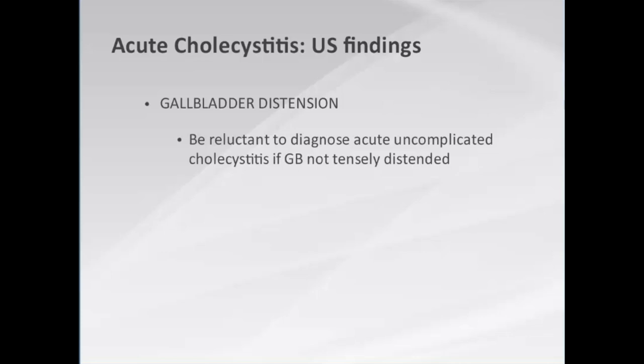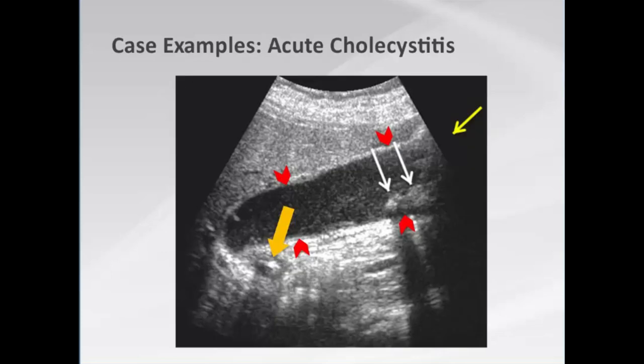Here is a teaching pearl: be very reluctant to diagnose acute uncomplicated cholecystitis if the gallbladder is not tensely distended. A woman in her late 30s with right upper quadrant pain for approximately 22 hours shows gallstones and maximal tenderness over the sonographically localized gallbladder — a positive predictive value greater than 90% for acute cholecystitis. Note also that this gallbladder is tensely distended, though the wall is not thickened and there is no pericholecystic fluid.